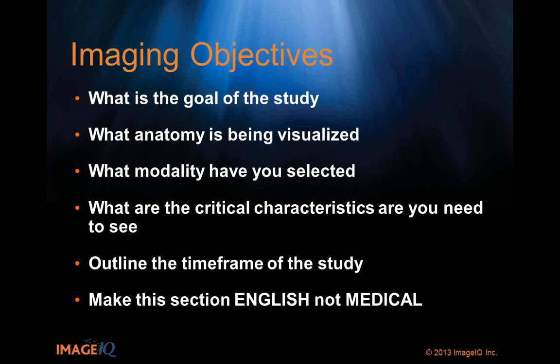And now you've added this extra imaging time point that they have to do for this study, with a special form, right, into their dictation system. Yeah, and you know what they're going to do, they'll be like, oh God, I have to do this again. But if you describe it to them and they're engaged, they might be more willing to act. Let's say a patient came in and you ask them to achieve a specific position and they can't do it. They might just say, screw it, I'm just going to image the patient.